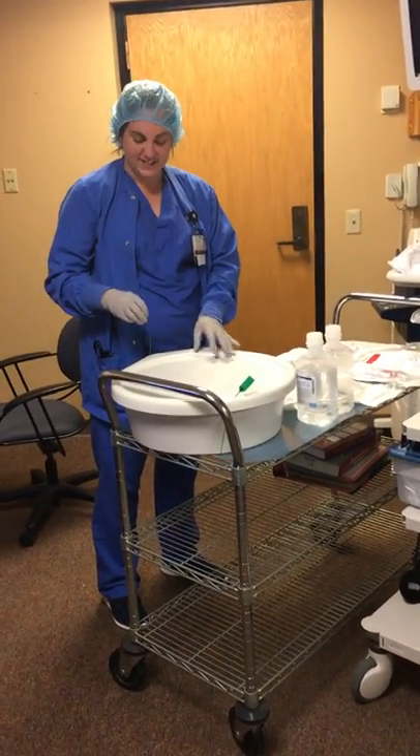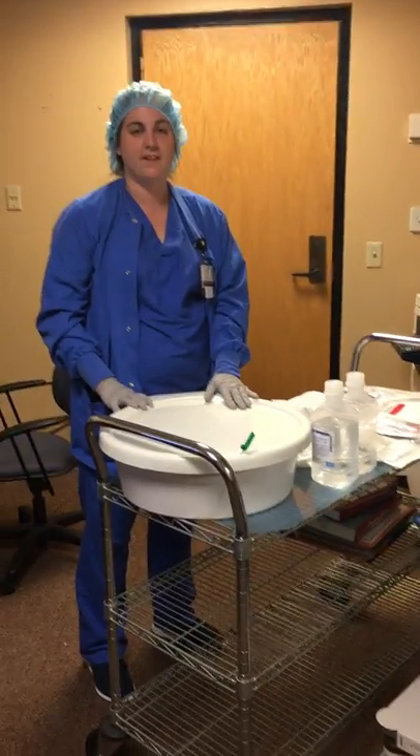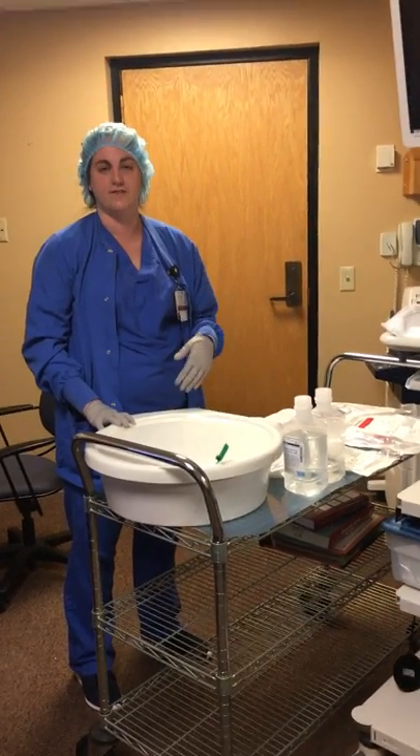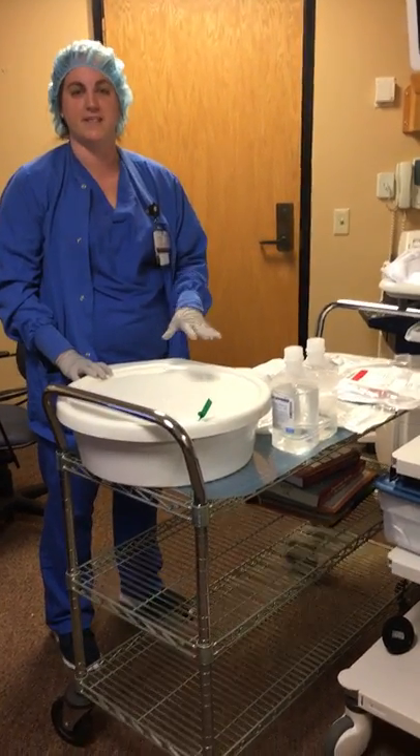I'm going to tell you today how to set up scopes, how to get everything ready during the case, what to do, and then afterwards how to do the pre-cleaning so that it's ready to go down to SP and be processed.